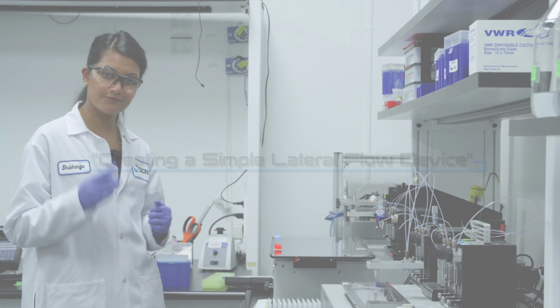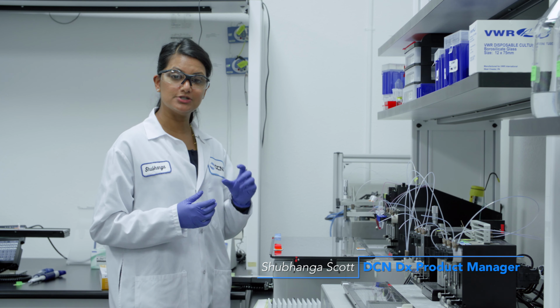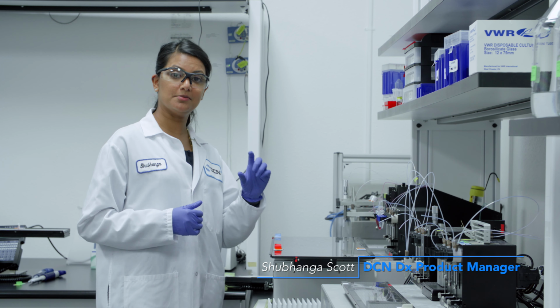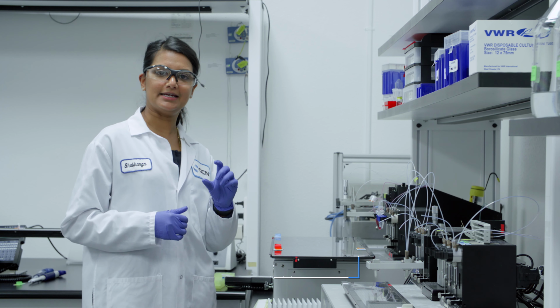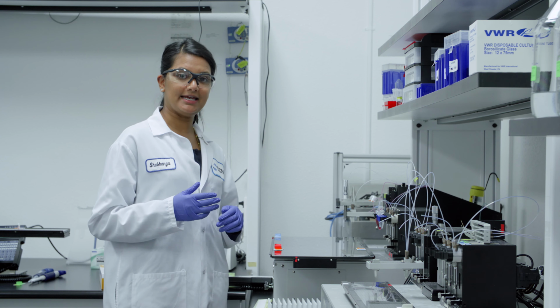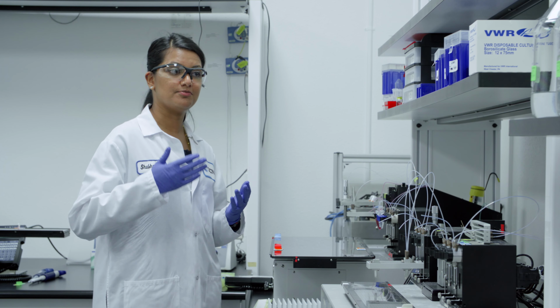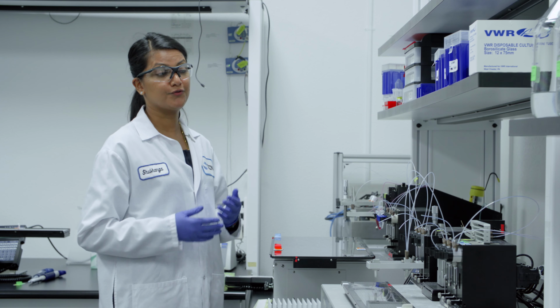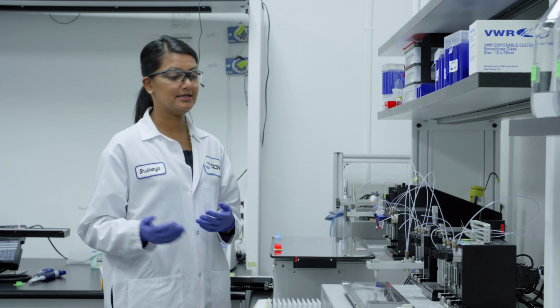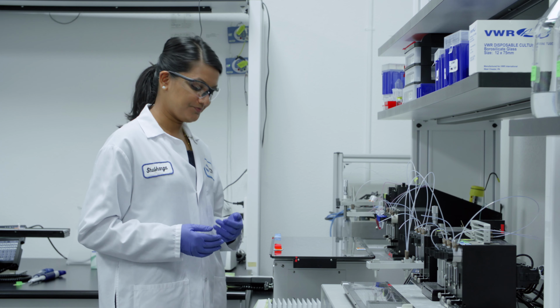So let's get started with making our lateral flow test. So step 1, we want to prepare in solution tubes our control line antibody and our test line antibody. That's why you see 2 lines. So the test line antibody is the antibody that recognizes the thing you're testing for. So for pregnancy, it's HCG. It can be different for different applications.